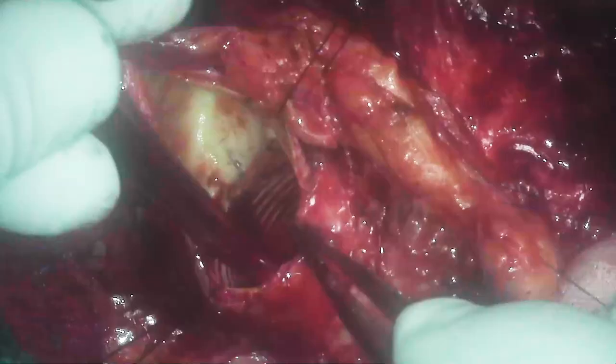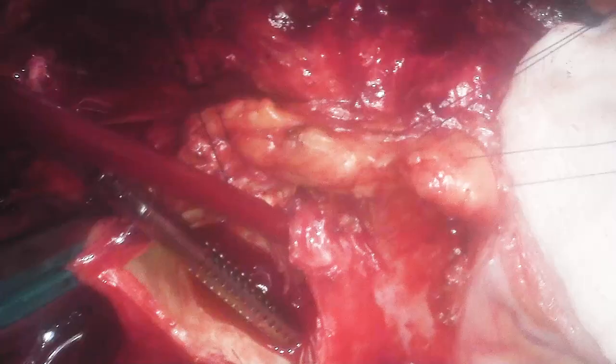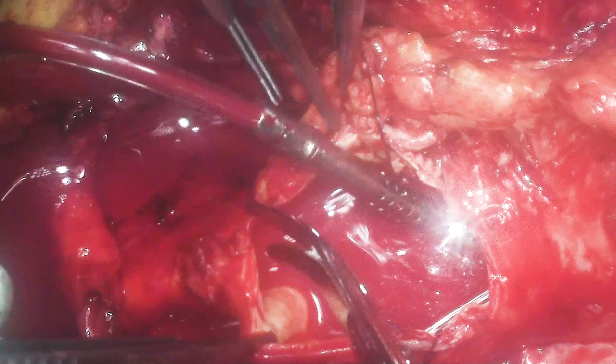There you see the distal end of the composite valve graft — it had come loose, as you can see. So we needed to sew to that. We're going to circ arrest here and drain out the blood. The patient is in steep anti-Trendelenburg. It's also important to flood the field at 10 liters per minute of carbon dioxide to displace any potential air and reduce the risk of air embolism.